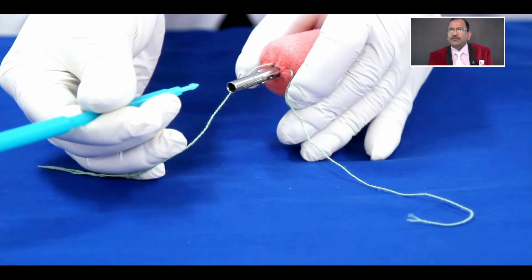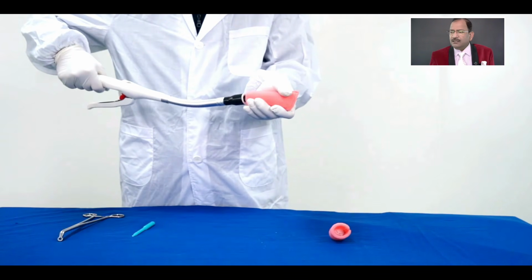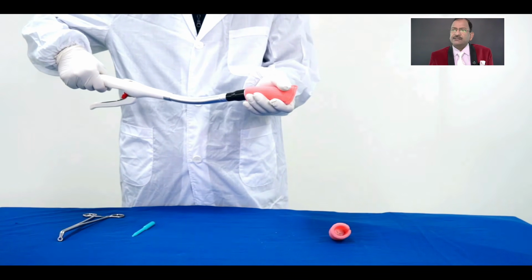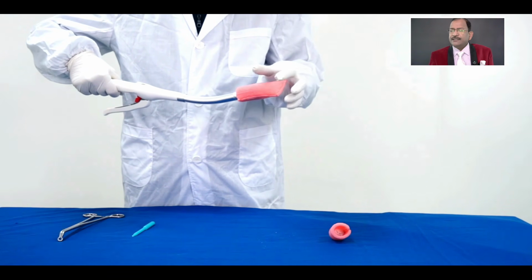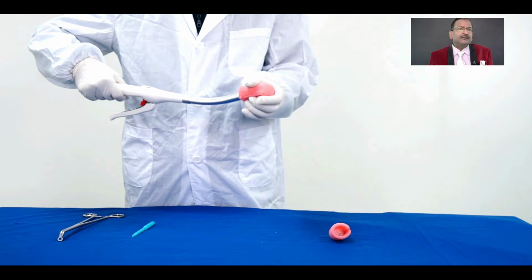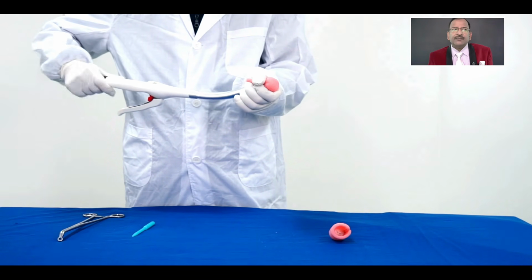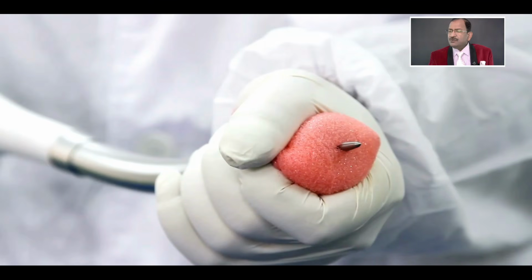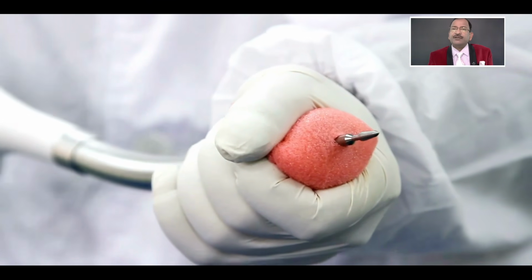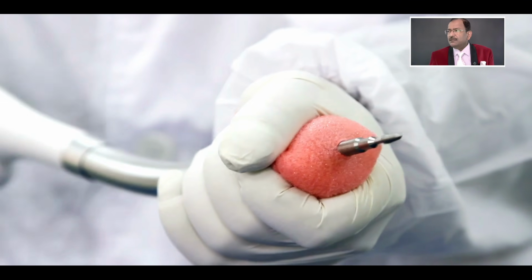Now, the gun will be pushed by your assistant through the anus, and it should perforate by the side of the staple line, not over the staple line, otherwise the staple line will open. And then once you rotate, this is the perforator. The perforator comes out and it will perforate the rectum.